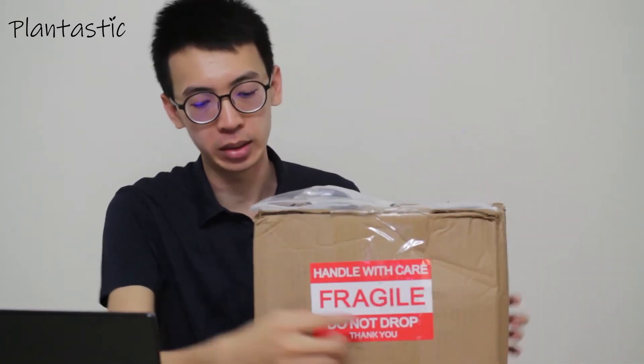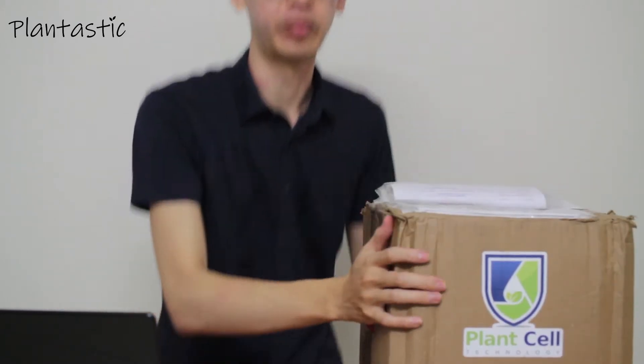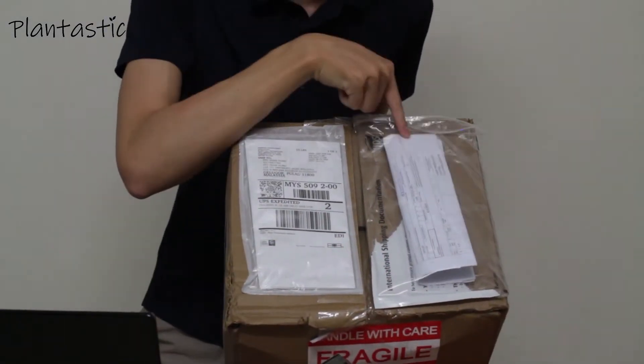So as you can see, this is their package with the front jaw label and their sticker. As you can see, there are two envelopes on the front of this video: the tracking details and also the clearance form.